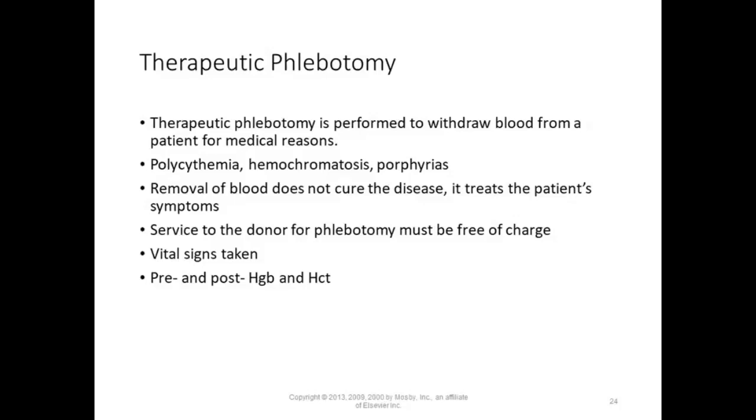Now, the collection of the blood. If a donor of low weight does give a unit of blood, or most of the time, if a patient fainted or is experiencing nausea or dizziness and they have to stop the unit, if they get to at least 300 cc's, they're still able to use it.